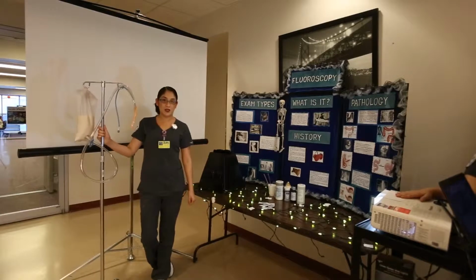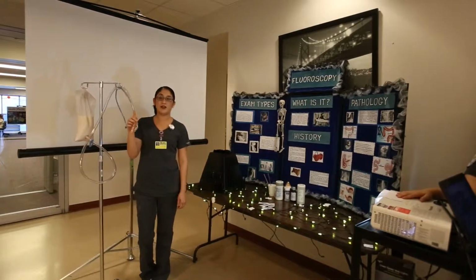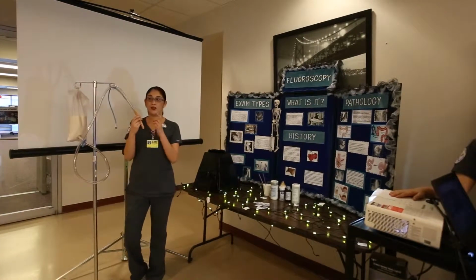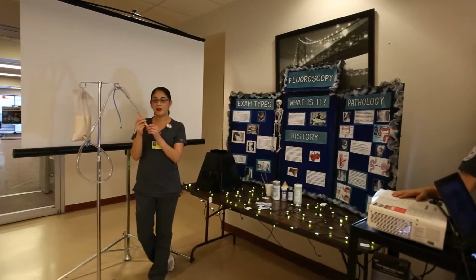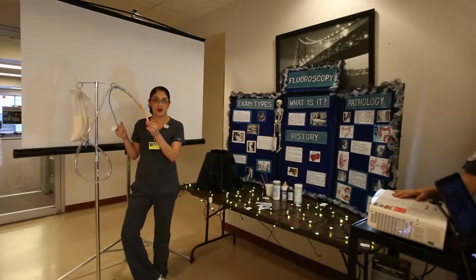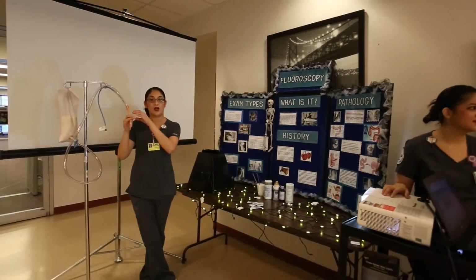So the radiologist will tell us how much he wants us to administer to the patient, and we do have to administer it rectally. We'll insert the tip 4 inches deep within the rectum. And then we have a little air tube right here where we will press the air, and the balloon will pop out. And that's the purpose of the balloon, so the contrast won't come out.